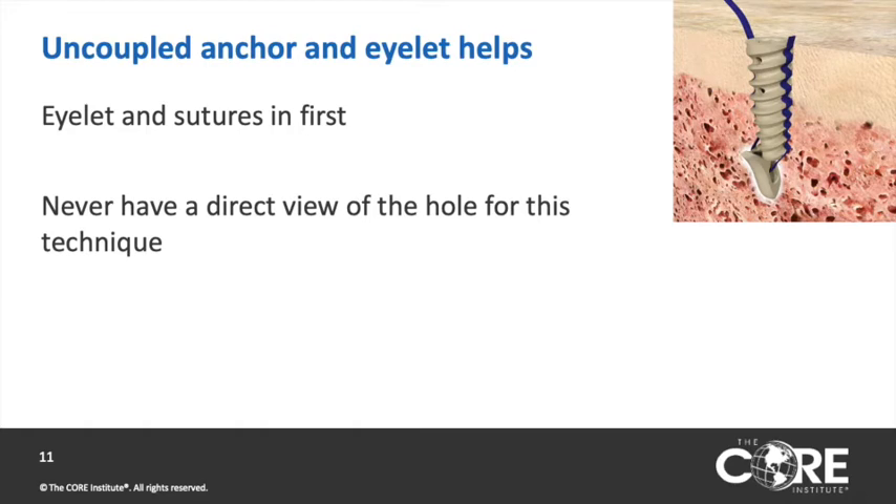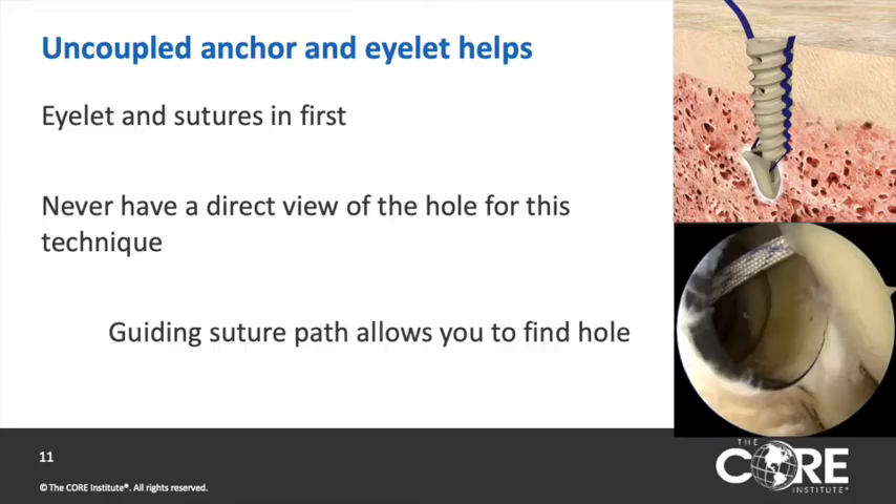This technique is facilitated by using an uncoupled eyelet and screw. If you create a bone socket using a punch, you never have a direct view of that socket. Using the uncoupled eyelet, the sutures can be used as a path to guide you back down to the bone socket to facilitate screw insertion.